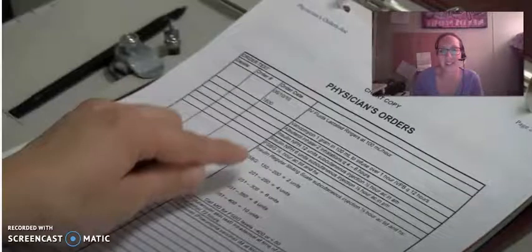Hello class. This video is going to be about mixing two insulins, and this makes sense to you because you're working in the diabetes content module. This video is strictly skill based. You should have a very solid understanding of diabetes at this point. That includes the pathophysiology, the complications, the nursing interventions, and things like that.